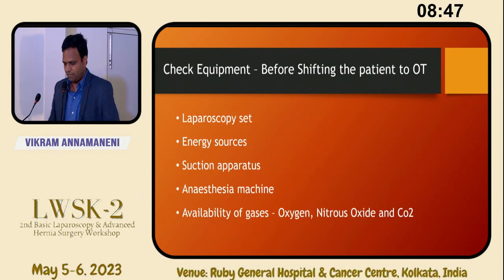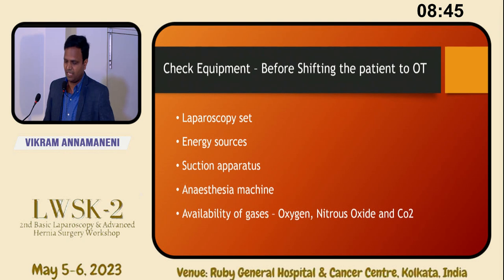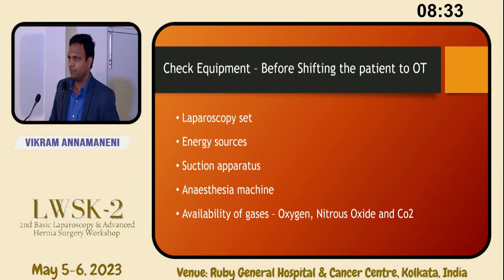Another thing: before shifting the patient to OT itself, you should check the equipment. Switch on the laparoscopy set, every unit: monitor, insufflator, light source, camera processor. Check with your own eyes that it is working. And check the function of energy sources. In a small setup, usually we have monopolar and bipolar cautery. Switch it on and see whether it is functioning or not. And check the suction. It doesn't take much time, just switching on everything and checking.